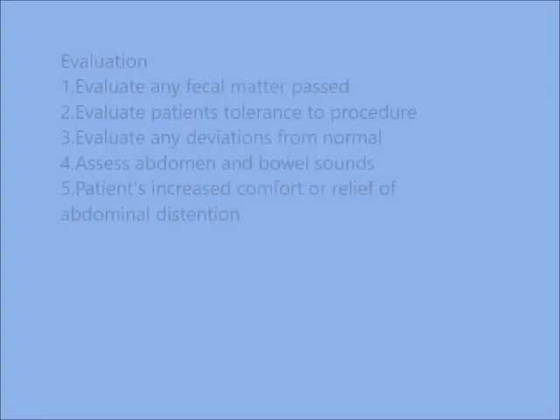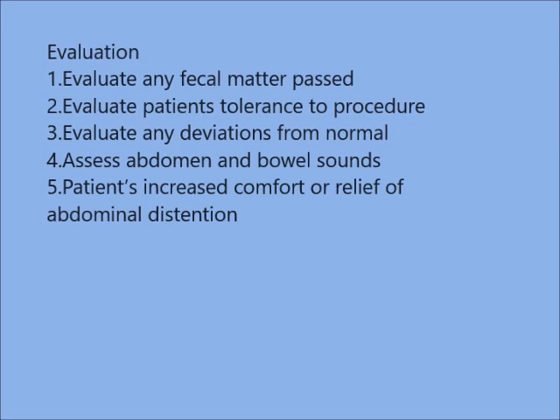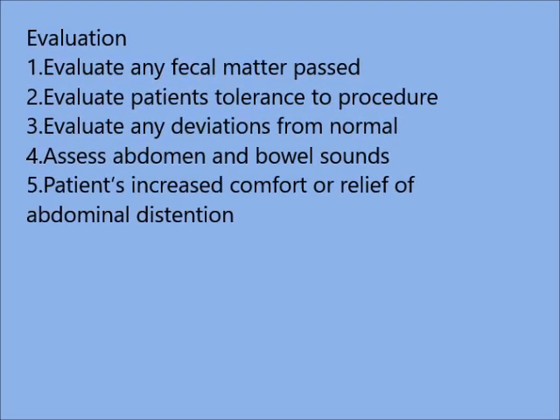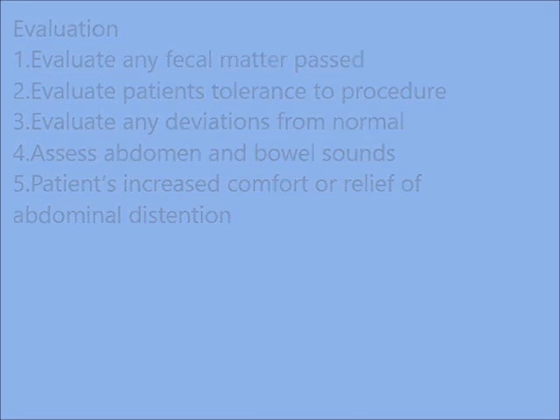After you have performed hand hygiene and cleaned up your equipment, evaluate the following. Any fecal matter passed, the patient's tolerance to the procedure, any deviations from normal, assess the bowel sounds, and the patient's increased comfort or relief of abdominal distension.